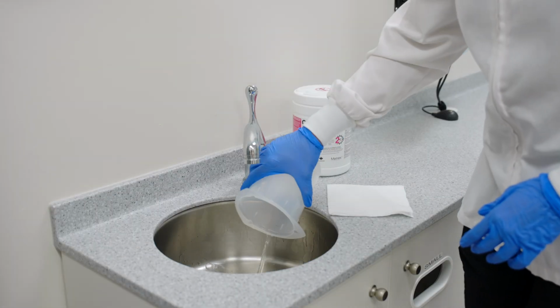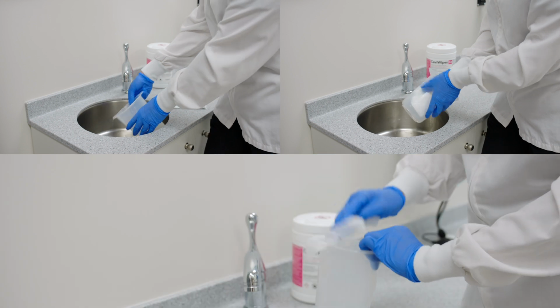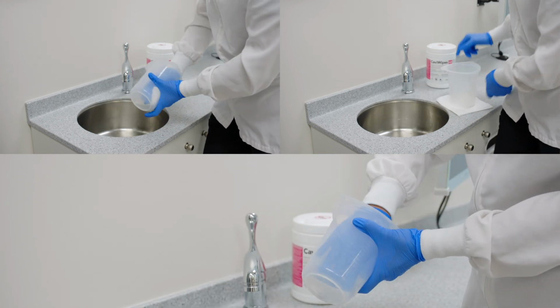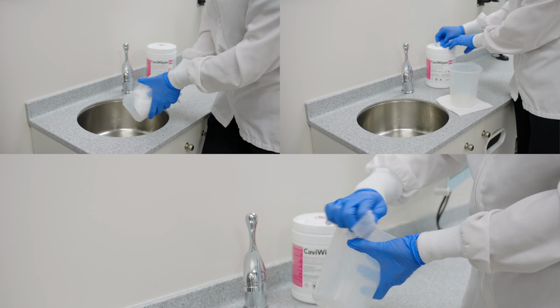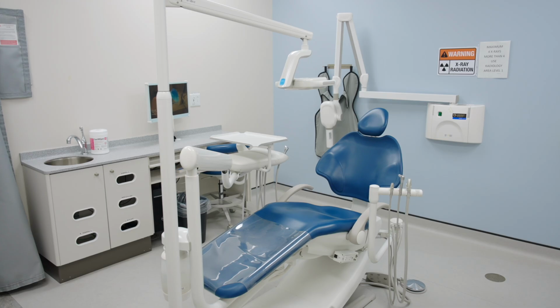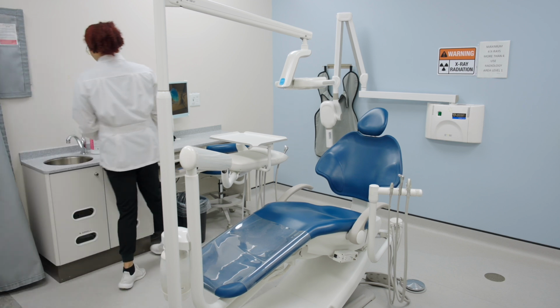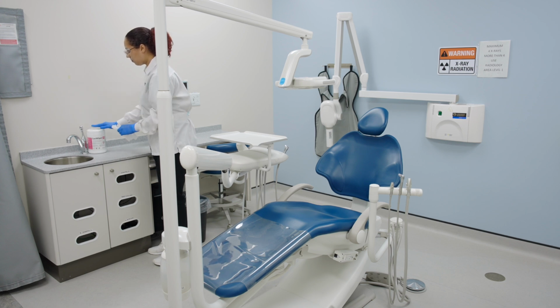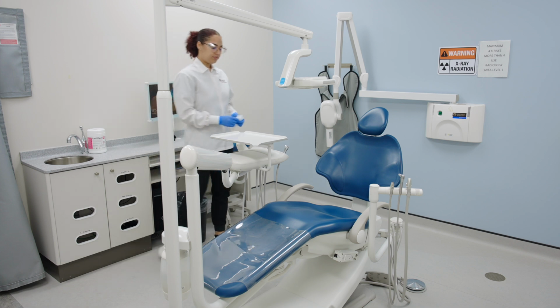Once finished, rinse, dry, and disinfect the beaker using a moist CaviWipe. Between each patient, the same lines must be flushed for 30 seconds. Next, dispense 2 CaviWipes and perform a visual inspection of the cubicle. If you notice any blood, saliva, or other debris, be sure to clean this first before beginning to disinfect.